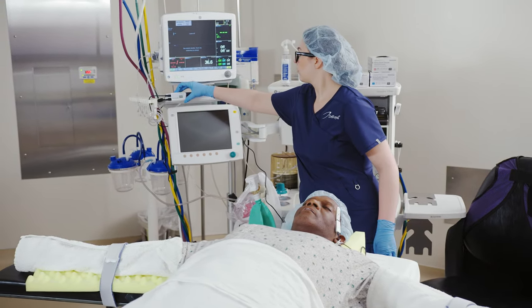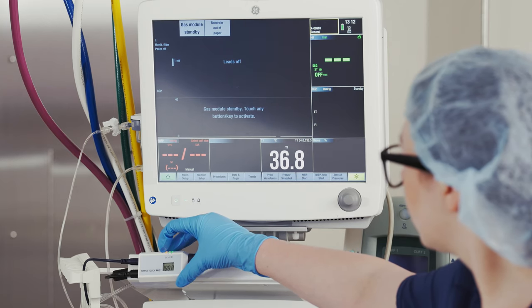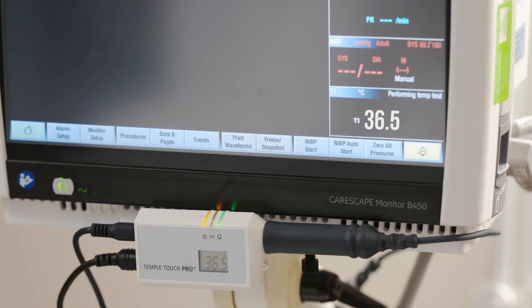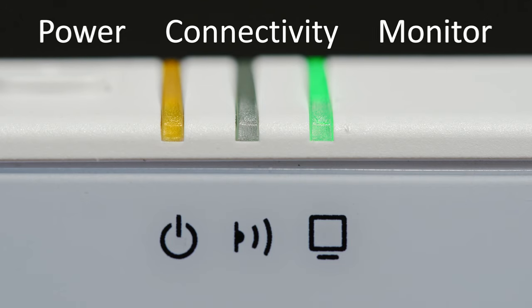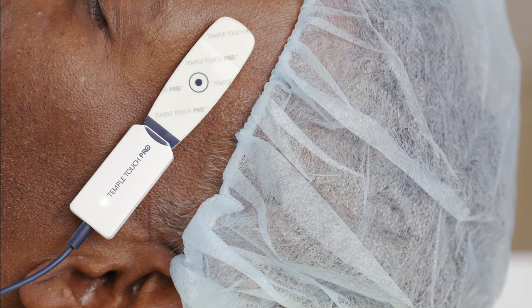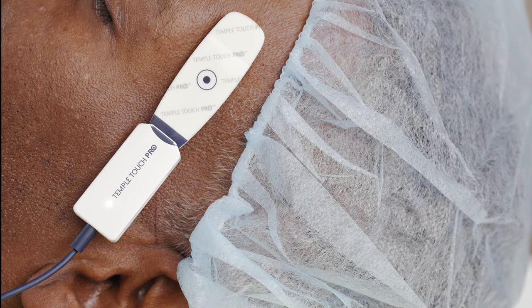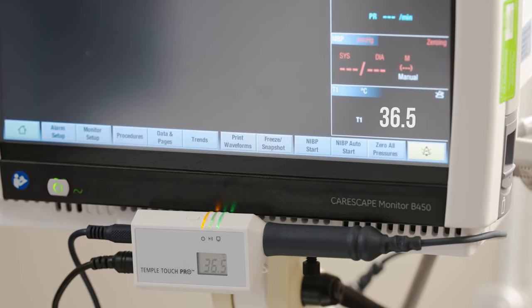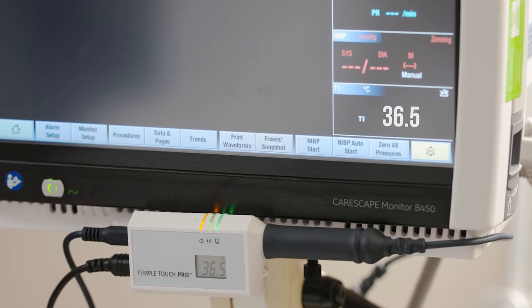Restart the MCU by pressing and holding the reset button for three seconds. The solid green monitor LED indicates the MCU is properly connected to the patient monitor and transmitting data. The green connectivity LED will start blinking, and the connecting cable LED near the sensor will turn on and stay on constantly.